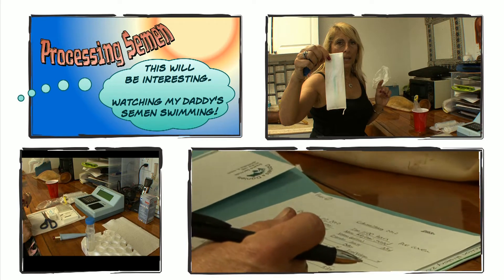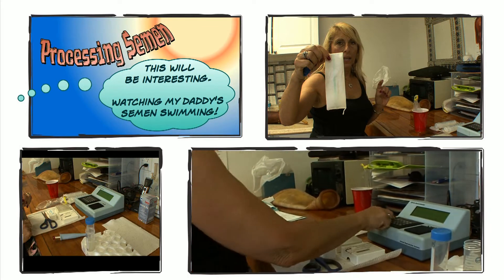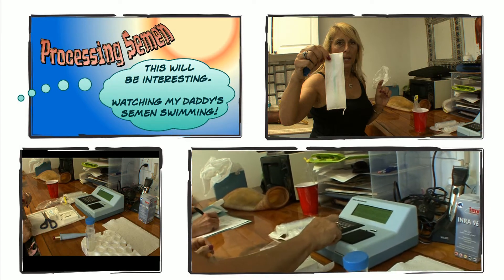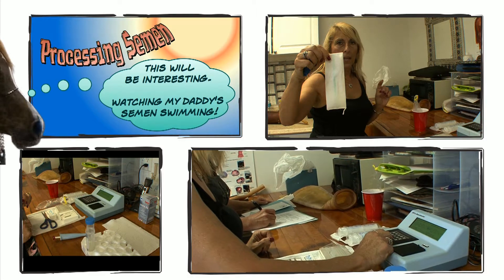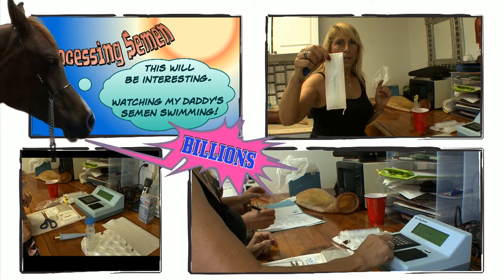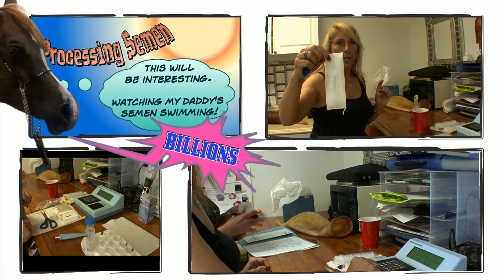I'm going to press go and enter the information — we have 33 mils — and press enter. We want a minimum of 1 billion, which is good. I'll press enter again, and now we need to look at our motility.